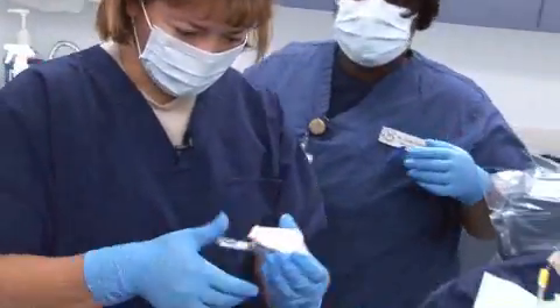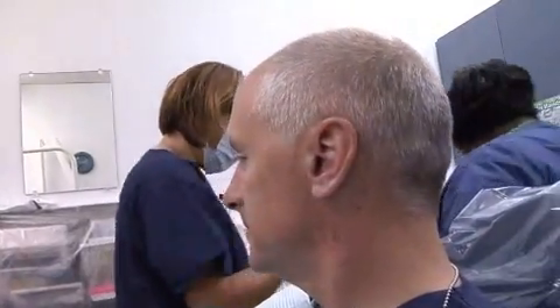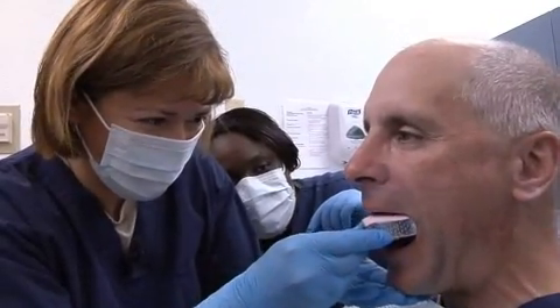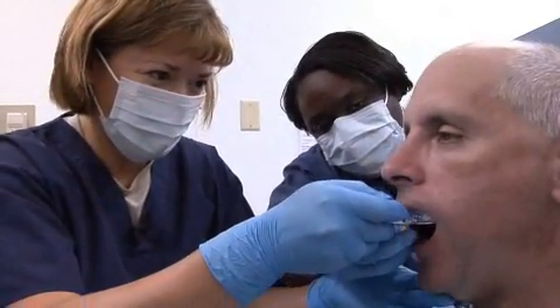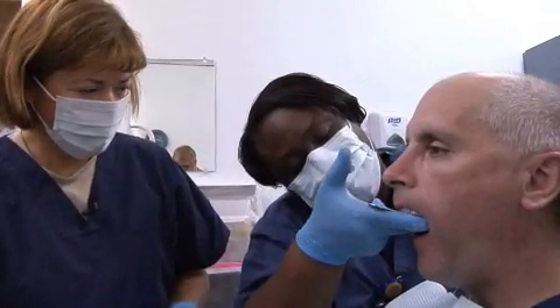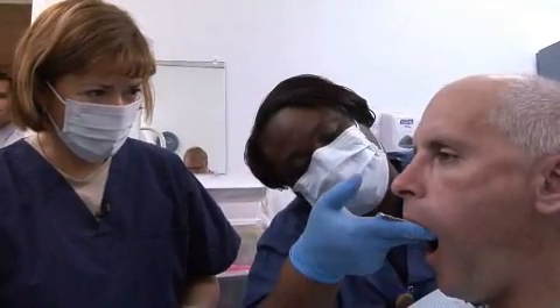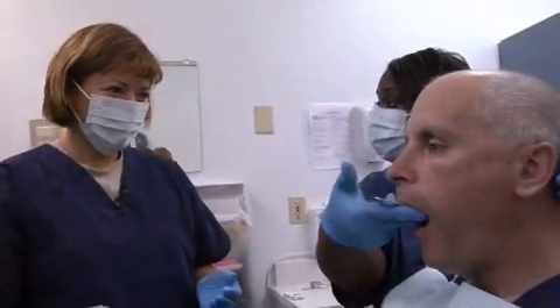Do you want me to go ahead and place it? No, I wanna try to place it. Let me get this excess off, cause that's gonna be gross. I'm gonna do it very gently. Need you to relax though. Then kind of rotate it in there, slide it back, and then just push it up. Breathe through your nose, sir. If you feel like anything is running to the back of your throat, you can hold your head over and touch your toes, and just keep breathing through your nose. Don't make them laugh. We do put them in a weak headlock.